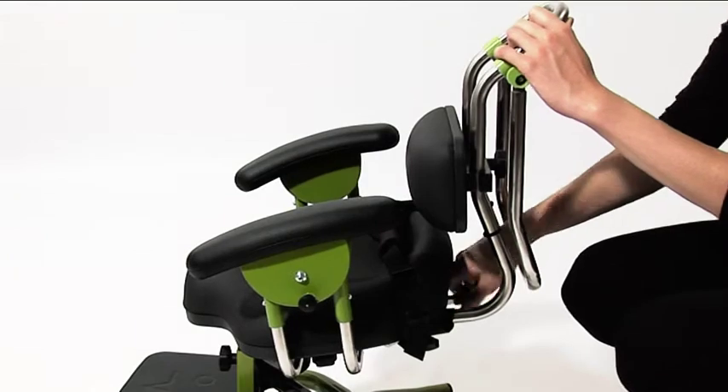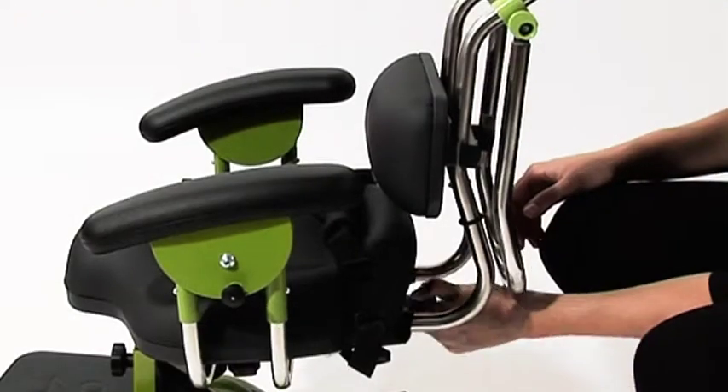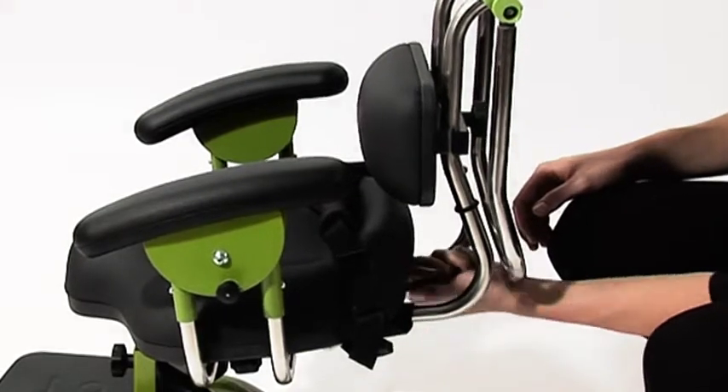To adjust the angle of the seat, turn the handwheel clockwise to tilt the seat backwards. Turn the handwheel anticlockwise to tilt the seat forward.